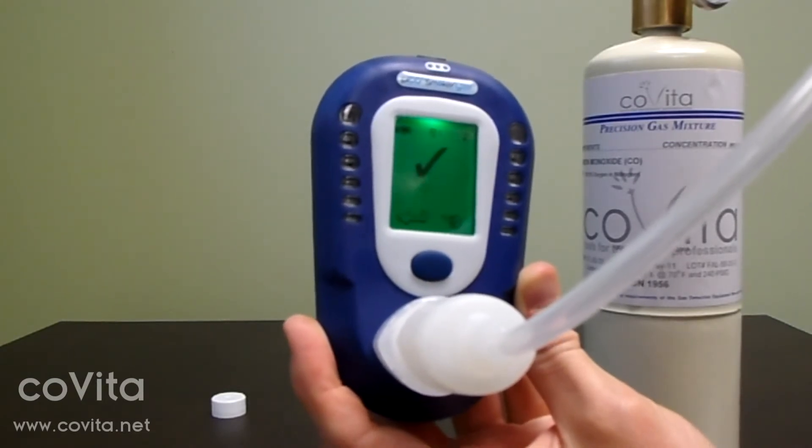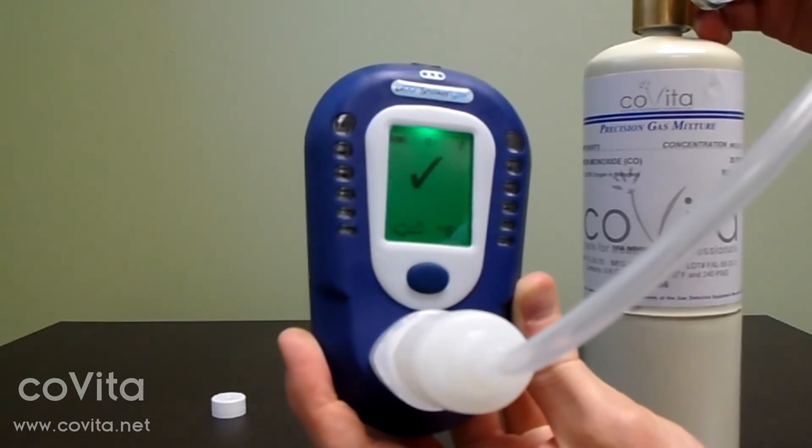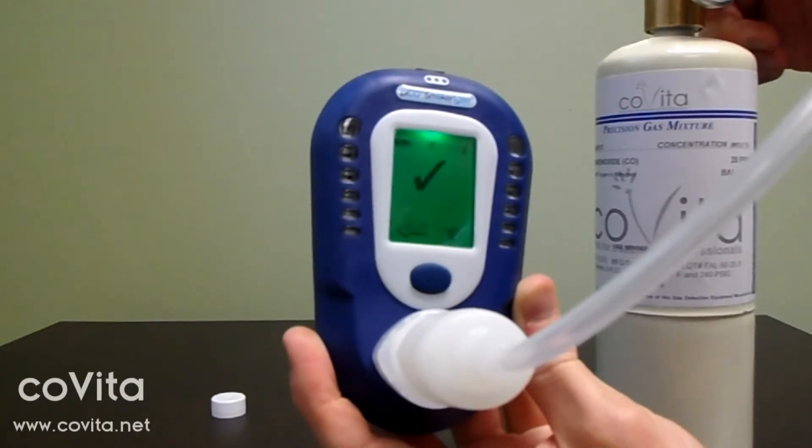Calibration is complete when you've received a check mark or an X on the screen. Immediately turn off your gas. If you receive an X on the screen, restart the calibration process. If you continually receive an X, call Covita for technical support.